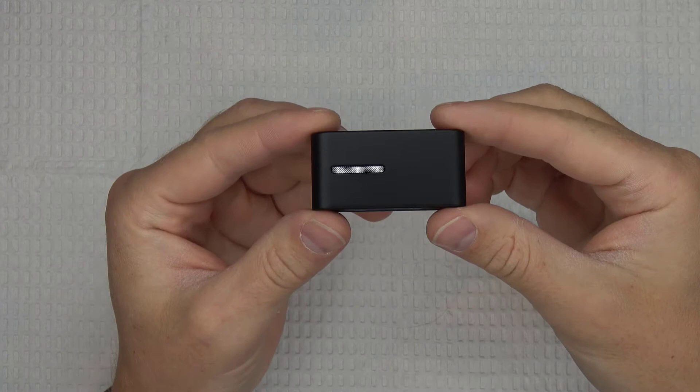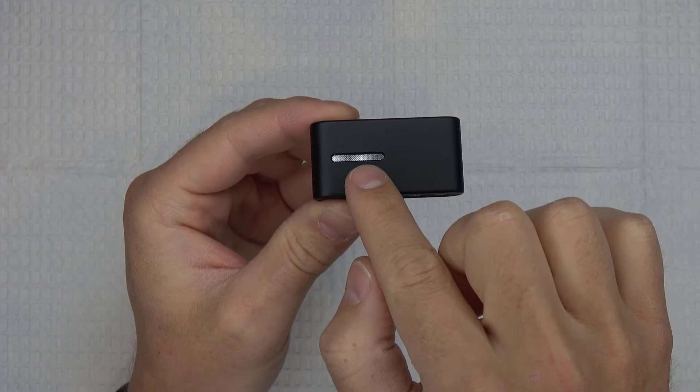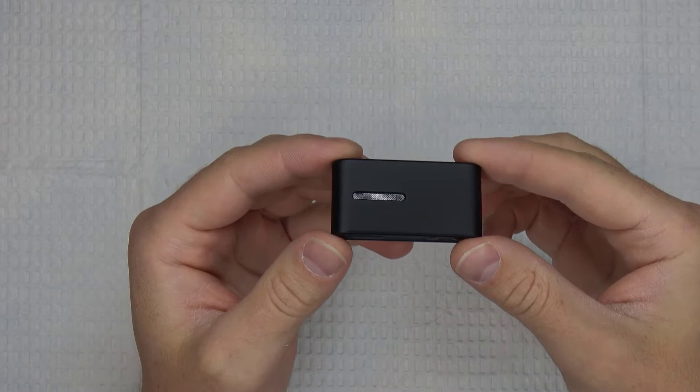If you have compatible hearing aids, or if you're thinking about getting some newer Oticon hearing aids, then consider this tutorial and setup video as your introduction to the world of Connect Clip capabilities. Without any further ado, let's get started with setting up the Connect Clip. This is the Connect Clip, and here are a couple of its key components. The small silver opening on the front of the device is the microphone port — this is where audio is picked up when using the Connect Clip in the remote microphone mode or the hands-free phone call mode.